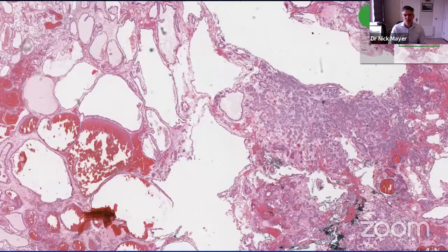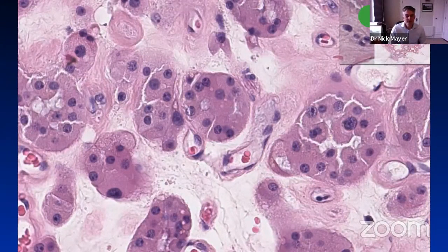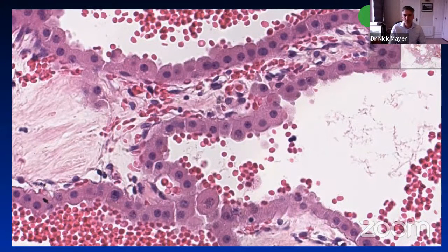If we go into the smaller nested area at higher power, the cells are oncocytic, with regular round nuclei of varying sizes and nucleoli of varying sizes as well. There's focal binucleation, there's no mitotic activity or necrosis microscopically, and there's a hypocellular background stroma. Some of the cystic areas are highlighted here and lined by similar oncocytic cells with nice round nuclei, no perinuclear halos or wrinkled nuclei.